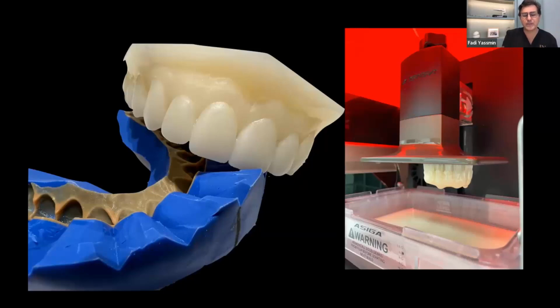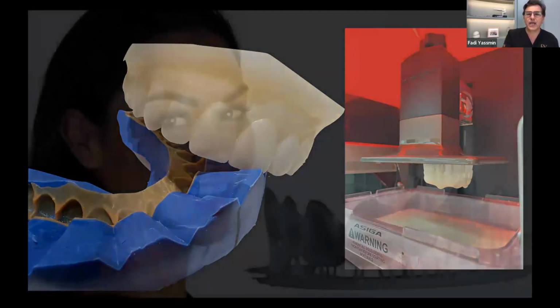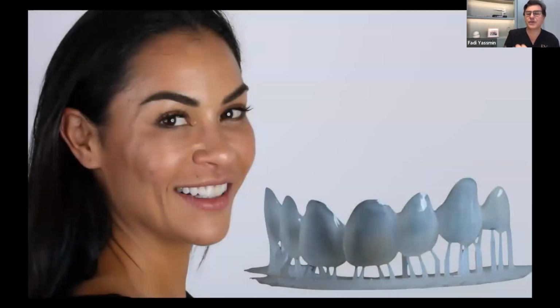We've got a specific silicone key that sits on top. And this is what we put in the patient's mouth and very carefully trim. And there's particular ways we trim the keys so that we get a beautiful, clean overlay. And again, it's only as accurate as the model and the key that you make.